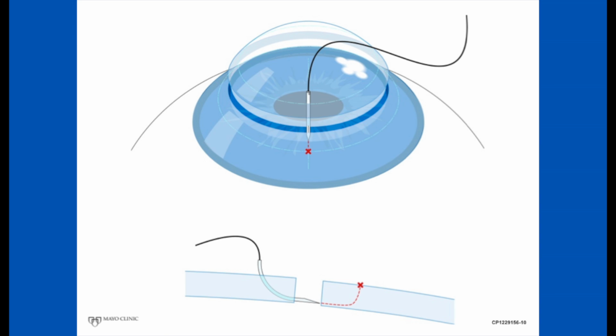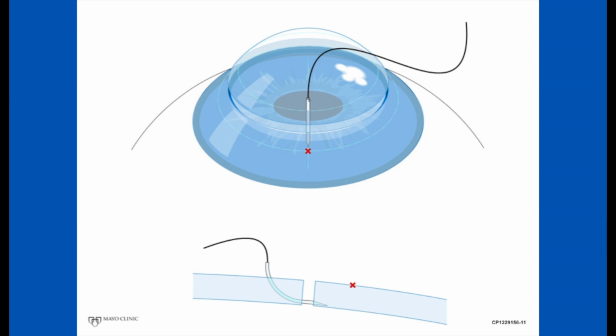We identify depth with two visual cues. The first cue is the same cue we used with the forceps tip on the deep graft margin. Namely, we look through the cornea, watching the resolution of the view of the needle blur until one knows one is deep. The second cue is one can see the front surface of the graft become flush with the front surface of the host. As soon as you have that position, engage the needle into the host wound edge, but just a bit. Keep your gaze on the needle tip to make sure it remains stationary.